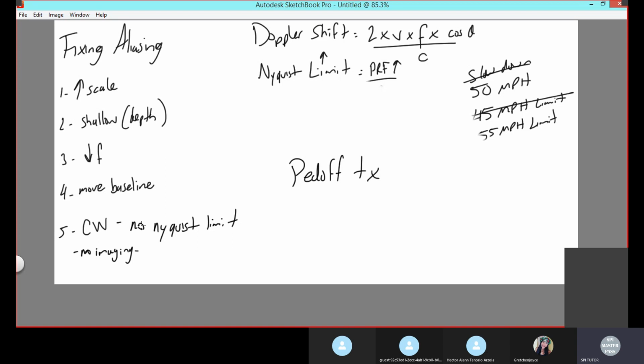But the moment we switch to the Pedoff transducer, this is a strictly continuous wave transducer. Okay, it's tough to scan with this. I practice as much as I can, but it's tough to scan with this. Okay, because you have no image to guide yourself by. You're literally just hearing. You're waiting to hear a wave. That's literally it. You put the transducer down, and all you see on your screen is your spectral scale. And then you're just moving it around, moving it around, moving it around until eventually you hear this.